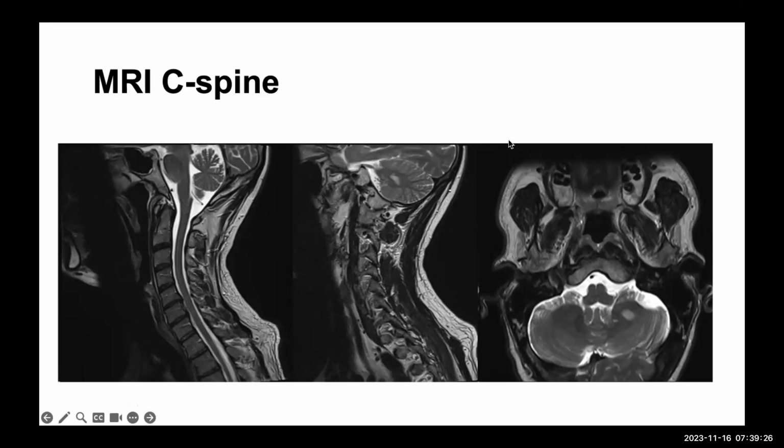Yeah, so on the axial imaging, it looks like we have a T2 axial all the way on the right, and on the left cerebellar hemisphere near the CP angle, we see some T2 hyperintensity, and sorry, in the imaging, I can't really see much else on that.